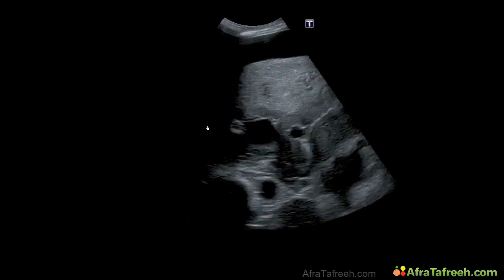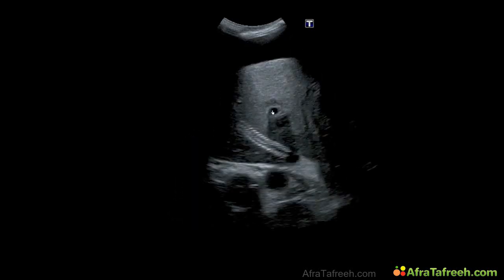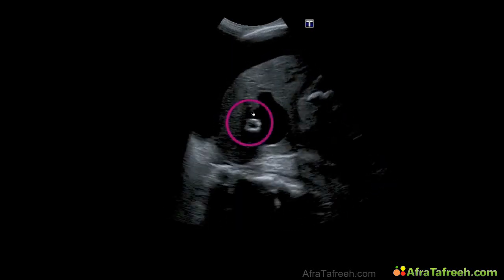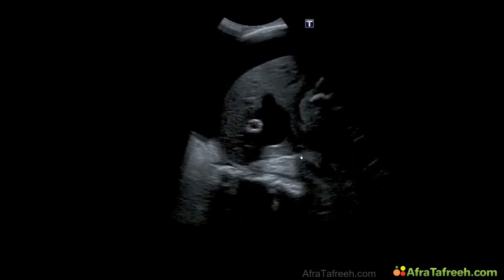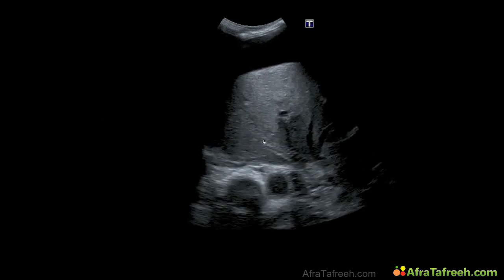In this video, again, a liver cirrhosis. This is the right liver lobe over here. And there's something special in this picture. Take a closer look over here. There's a structure we haven't seen until now. And this is artificial. It's a liver TIPS to help patients with his ascites.